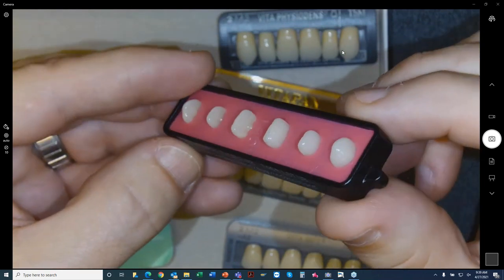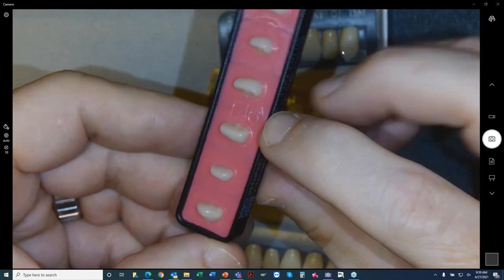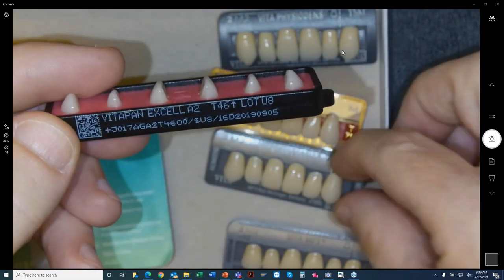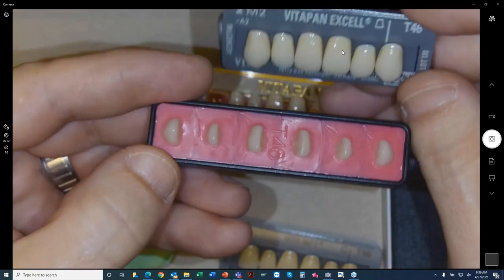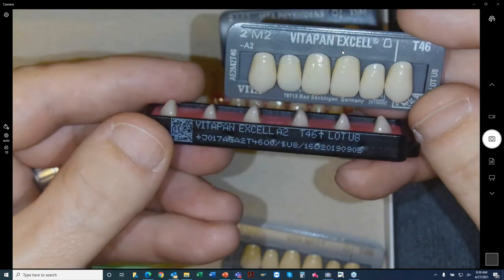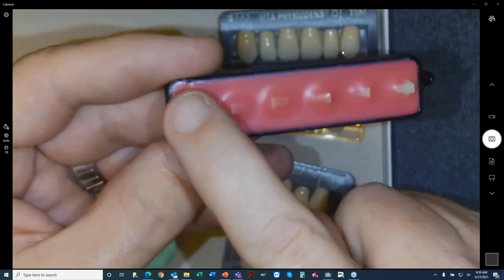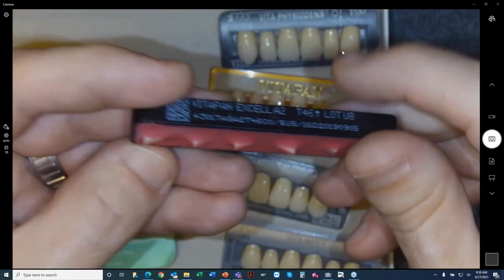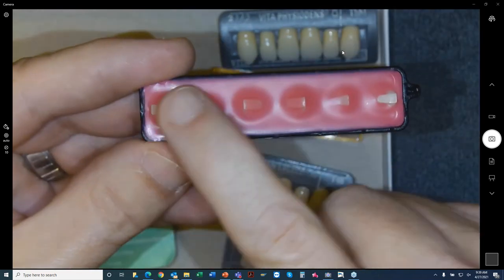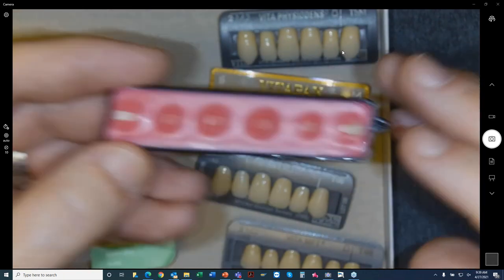On our Vionic DD frames, these are the anteriors. This is a T46. These are based on the Excel, but these are basically these teeth here. T46, T46, but they're embedded in a wax so that when they're milled, they only mill the basal side of these. They leave the incisals alone. So the mill will mill these to fit the frame, that printed or digitally milled denture base.